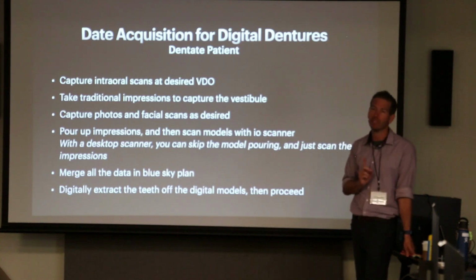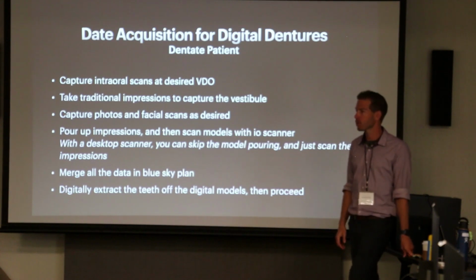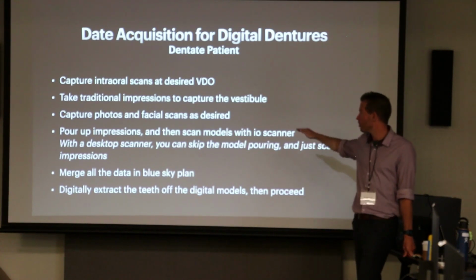So it really is saving you one step of taking your impression back to the lab, putting stone in it, pouring it, and making a physical model. Not a huge deal either way. So those are the two different workflows on how to get that data into Blue Sky.